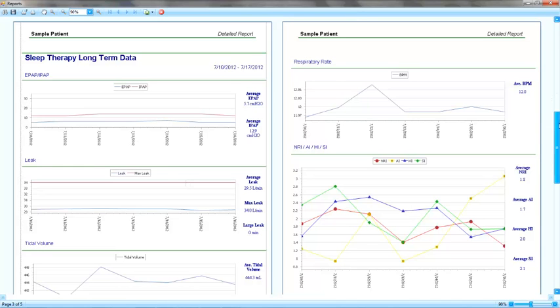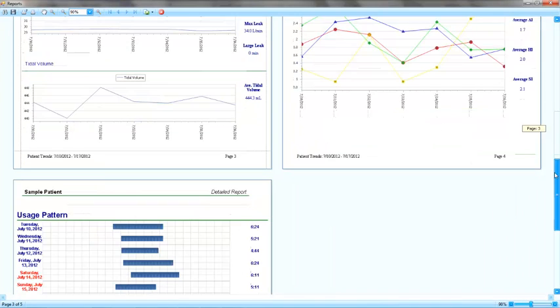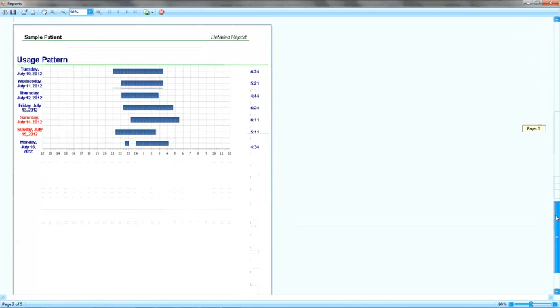5. Respiratory events indexes. This chart gives the daily values for the following indices: Non-responsive events index, Apnea index, Hypopnea index, Snore index. This is the basic outline of the patient trend report.